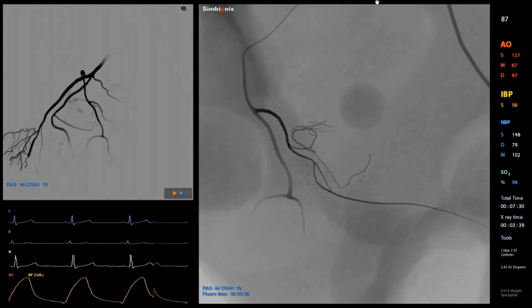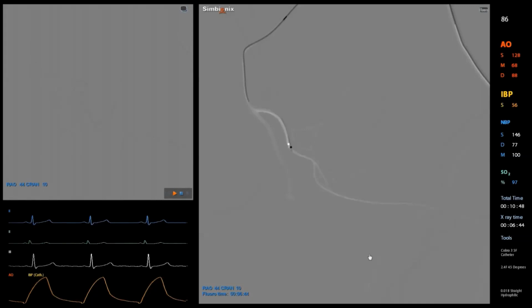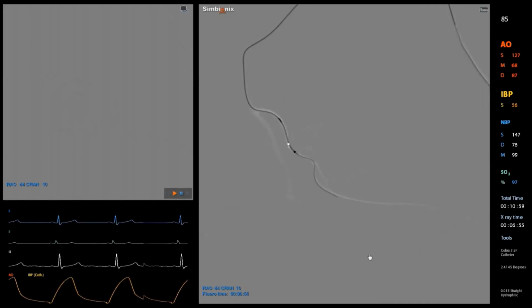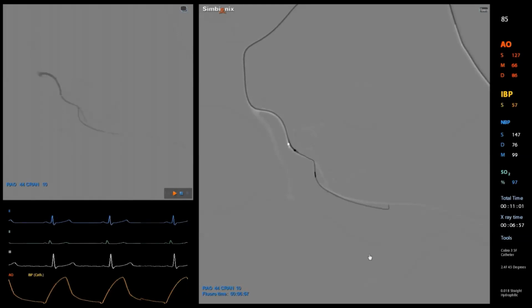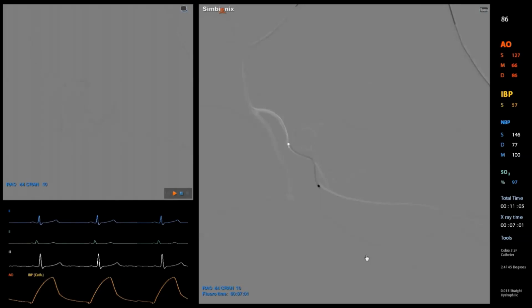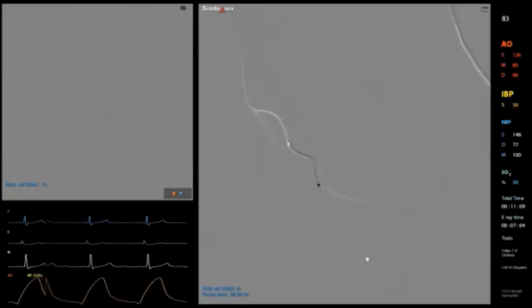So once you have catheterized the prostatic artery, you get an arteriogram, and in this case, you can see that there are some prostatic branches, and also there is a lower branch that goes very distally. Once we see this artery, it's an artery that is connecting to the internal pudendal artery, so it will fill the penile branch, and we have some connections.